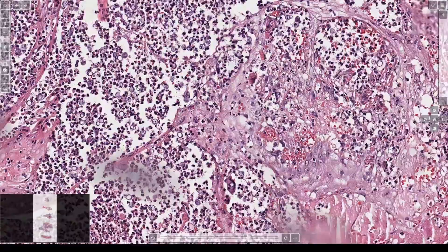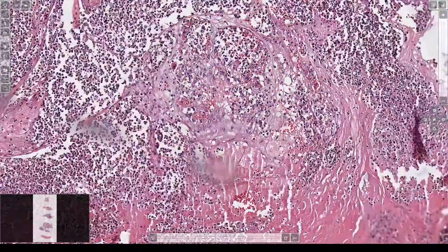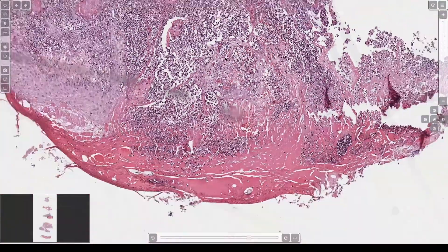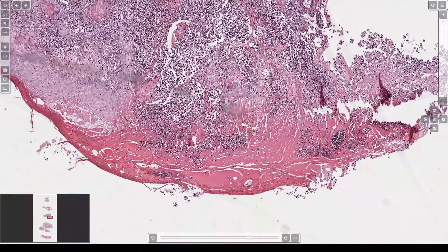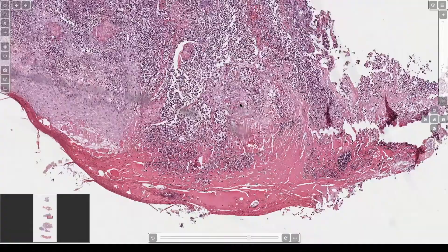You do tend to get a mixture of neutrophils and histiocytes. Anytime you see granulomatous dermatitis with neutrophils, always think of infection until proven otherwise. Or if you see granulomatous dermatitis with plasma cells, you often have an infectious etiology — until you've ruled that out, always keep that in mind.